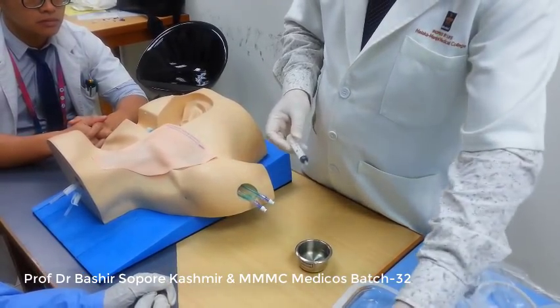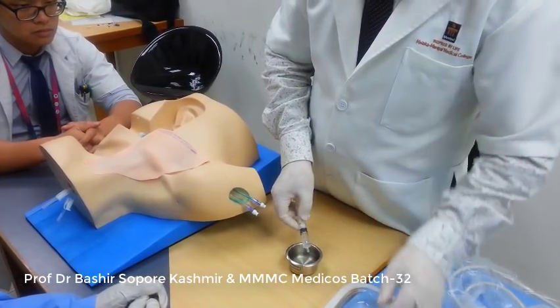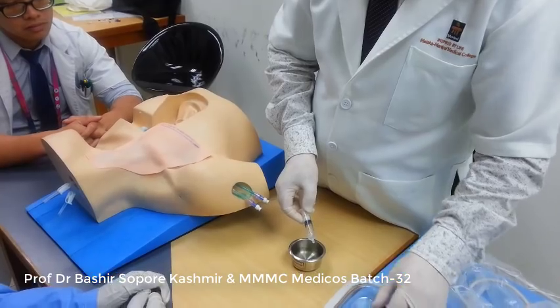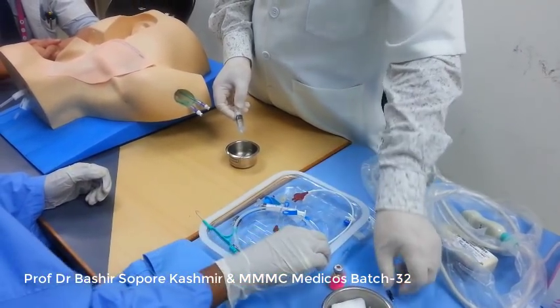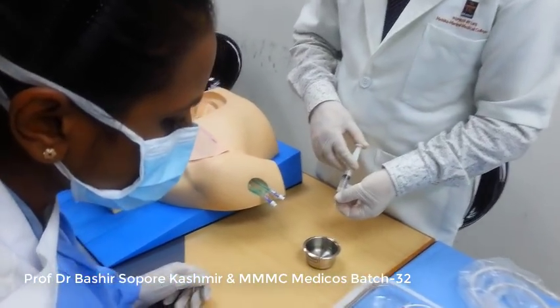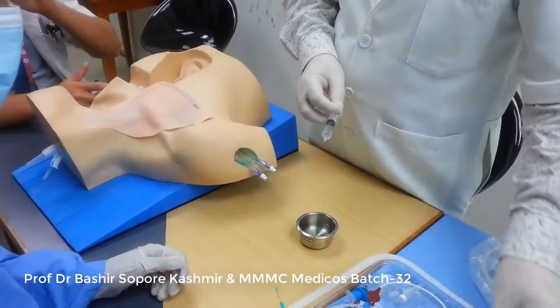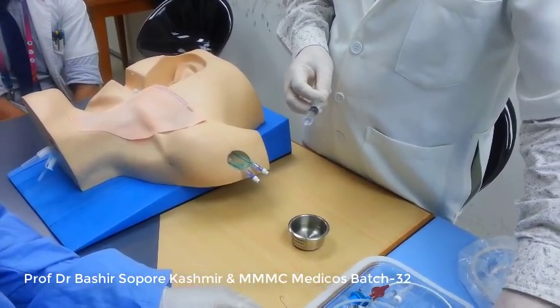Then we will see whether the needles are patent or not. This is one needle, so I check it here, and I see, okay, this is patent, isn't it? So I keep the needle here on this sterile cloth.